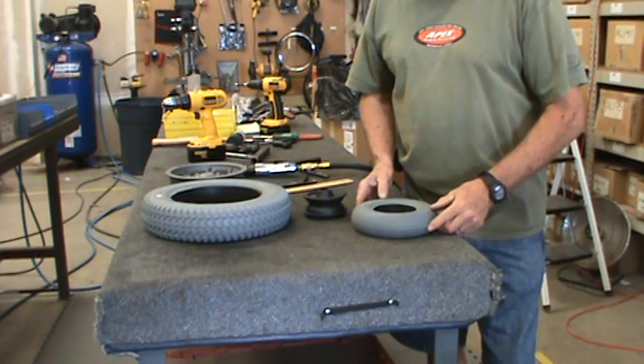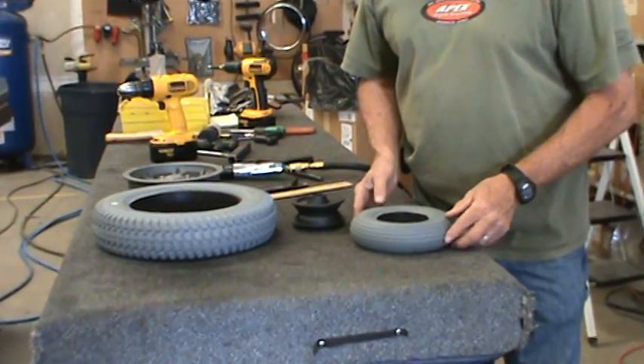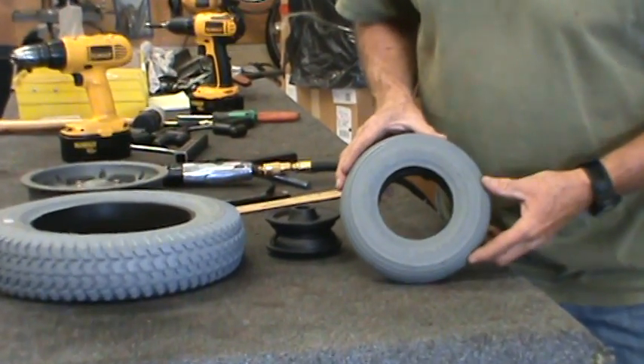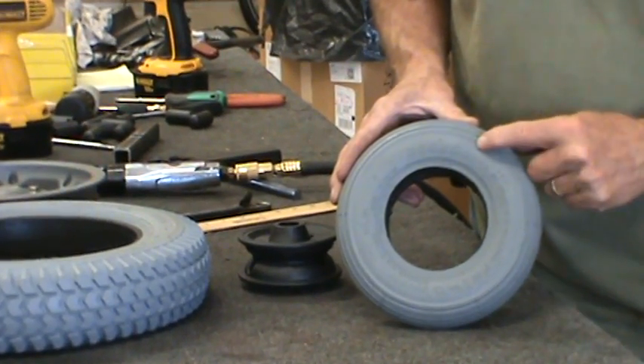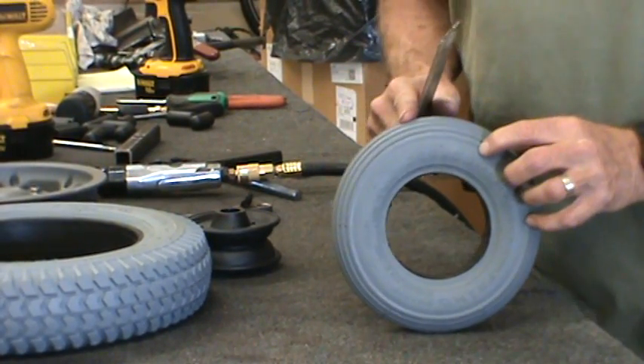This is to demonstrate how to order the correct foam filled tire for your wheelchair. This foam filled tire is a 200 by 50. Always try to get as many numbers off the side of the tire when you're going to order it as possible.